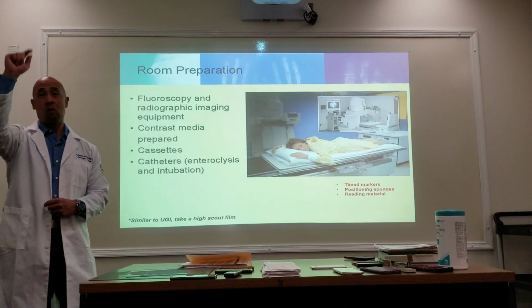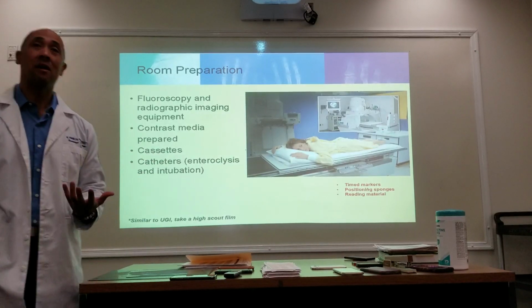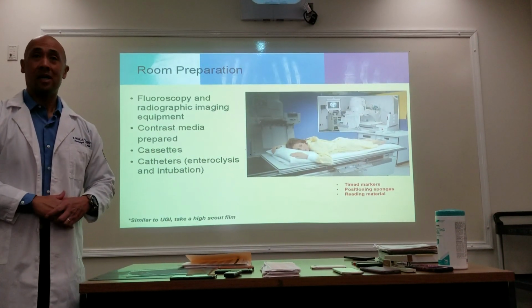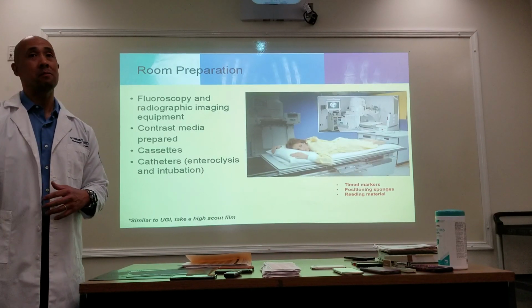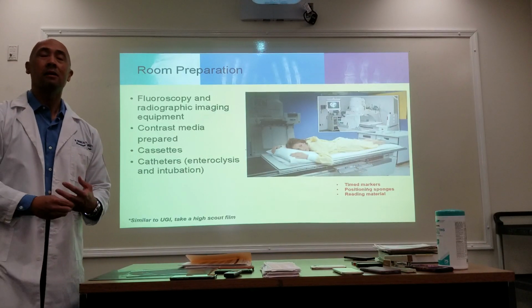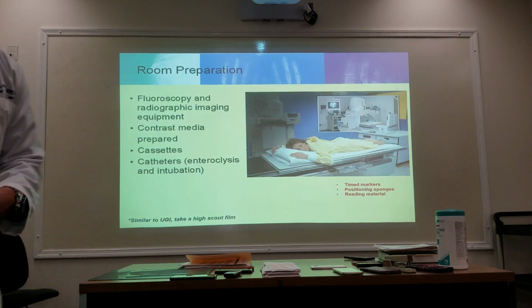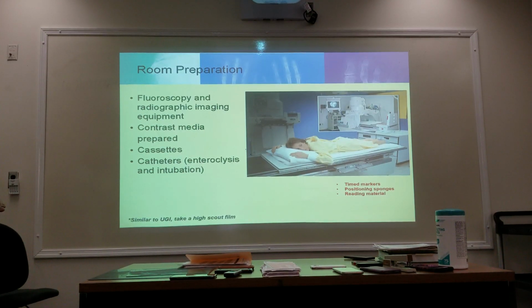But don't quote me on that. We've already talked about variations from place to place. Places that I've worked have always been a high KUB, so again I'm sharing my experience with you. You may end up in a hospital saying, no, don't do a high KUB, you should do a regular KUB. But it's still two scouts, one for the esophagram, one for the abdomen. Okay? All right. Any questions so far?